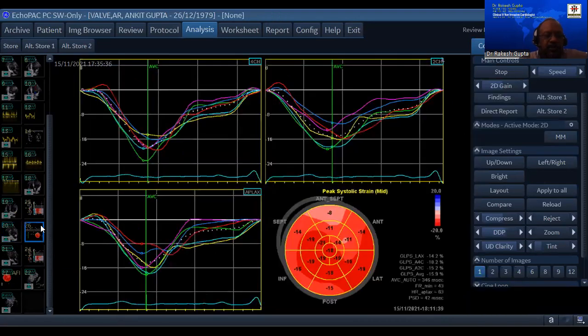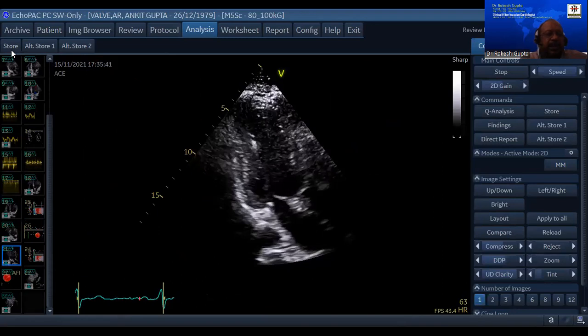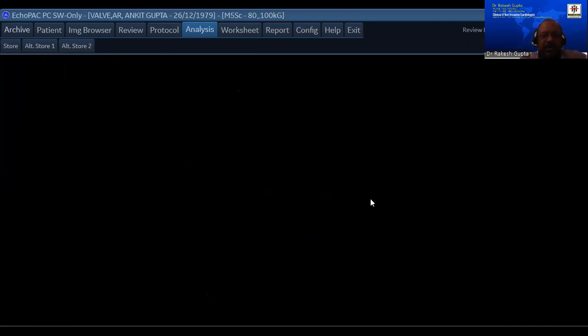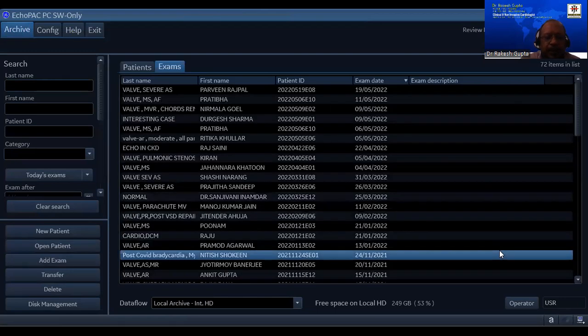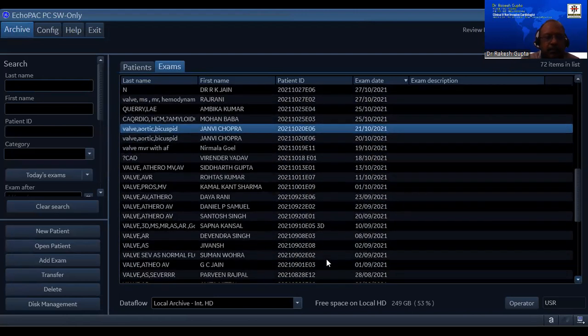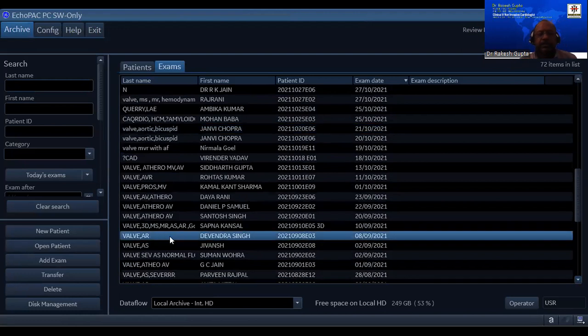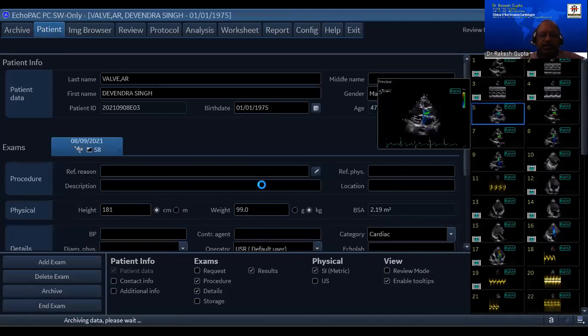No, we do not have the much needed AR. Let me just go back another slide. So it's just a trivial AR the patient was having. I'll have to find a bigger one. Yes. Very classical picture of this patient with severe aortic regurgitation.